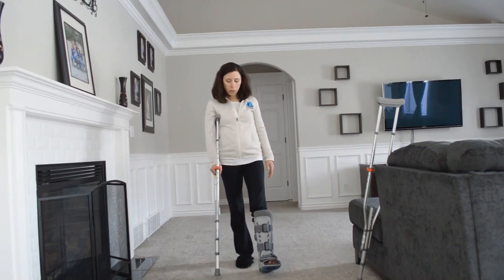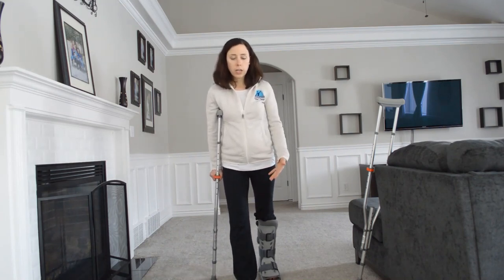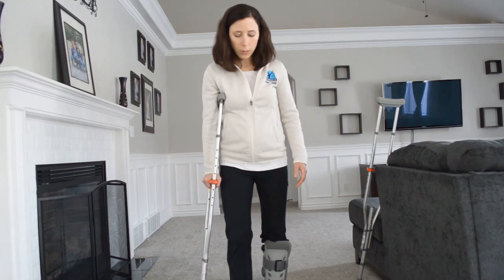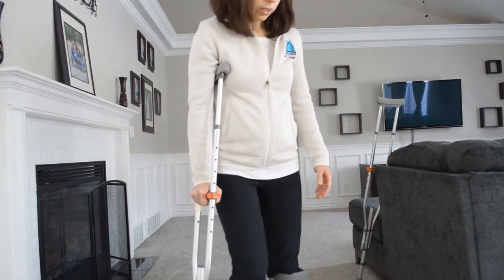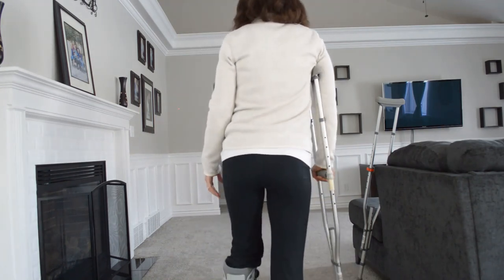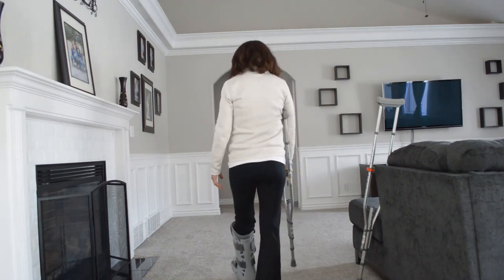You're going to step at the same time with your crutch and your foot on your injured side so that you can step through. Then you're lifting while you're putting weight on your non-injured side. Every step you take is going to be supported with the crutch.